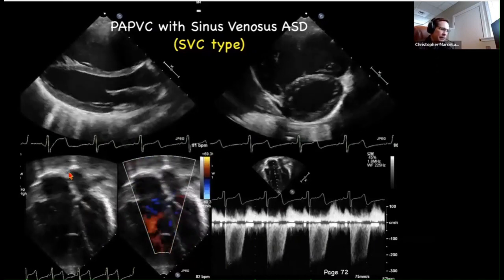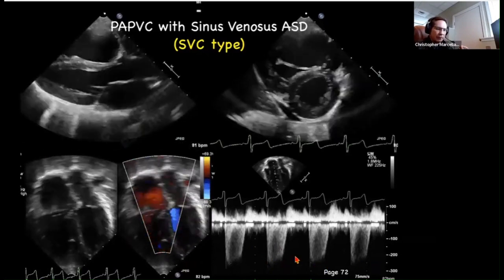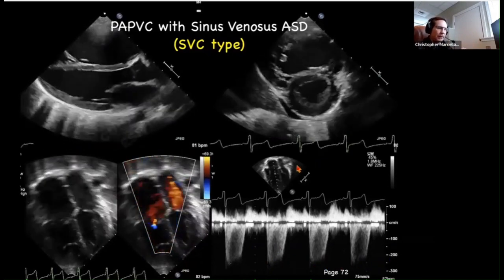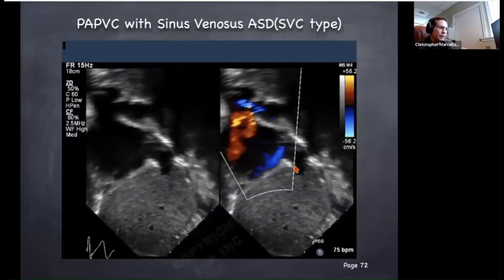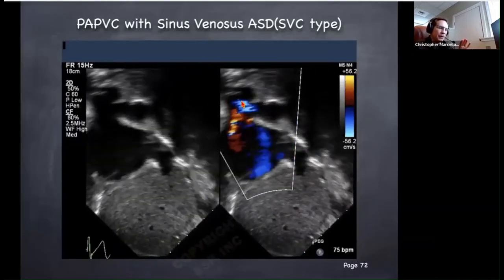The atrial septum at this point looked pretty intact. In most of these kids, you don't have elevation of PA pressures because they can handle this for quite a while. So the TR velocity is low, 2.5 meters per second. Of course, when you get down to the subcostal, this is where the rubber hits the road, so to speak.